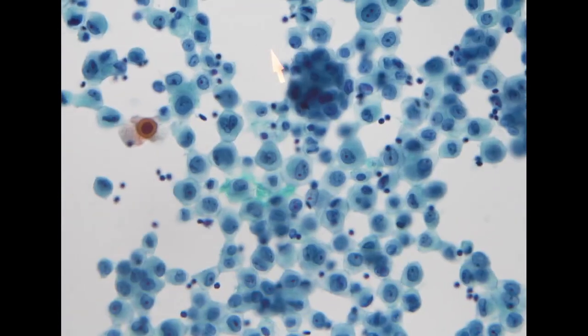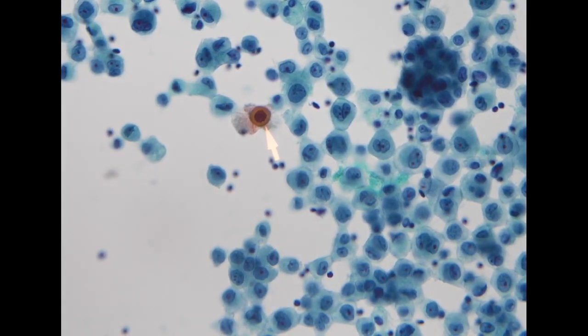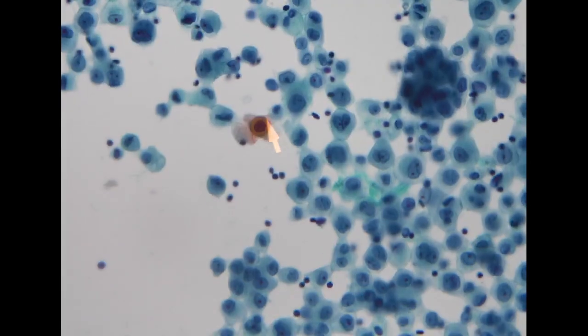The other thing is the presence of these orangeophilic cells, which is also quite uncommon in the specimen, because when we see cells with orangeophilic cytoplasm, usually we will think about squamous cell carcinoma, but in some patients with mesothelioma, the cells can also show this type of feature.